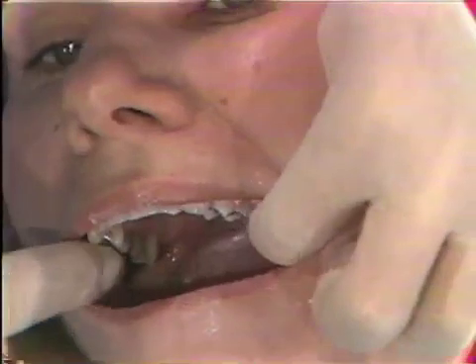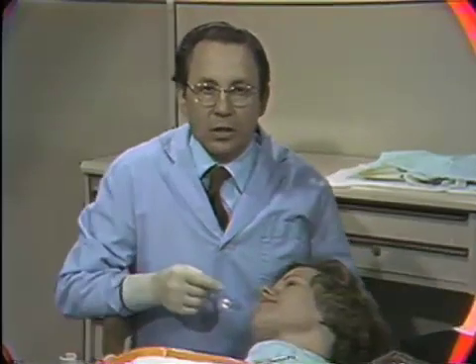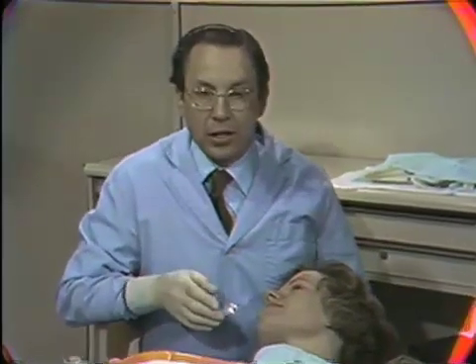The patient is instructed that they can very gently brush the occlusal surfaces of the teeth where the dressing is located, but it's preferable not to brush the dressing itself. The rest of the mouth the patient can brush as normally taught. The patient should take it easy to make sure they don't unnecessarily disturb the area with food, so they should eat a soft diet. The patient is given an instruction sheet with written information to read when they get home, to ensure minimal potential for problems after leaving the office.